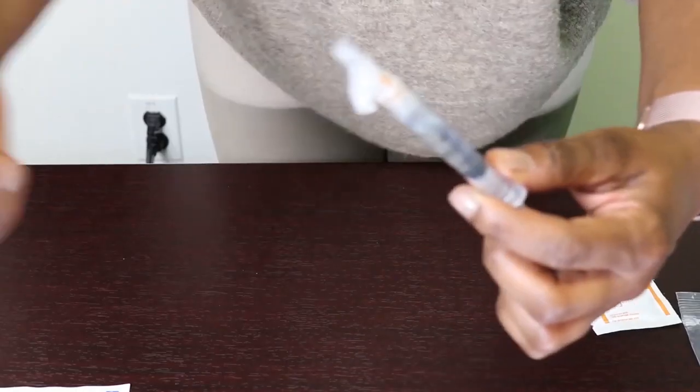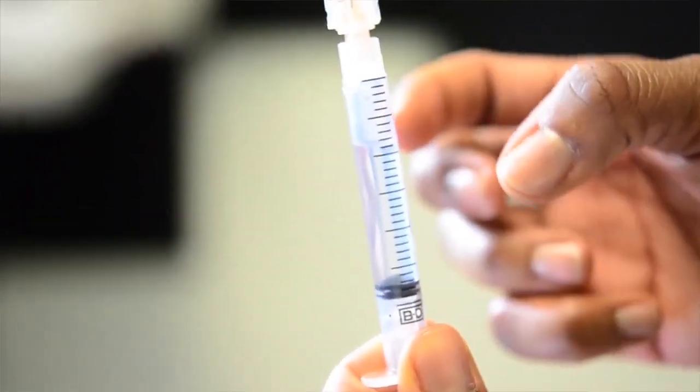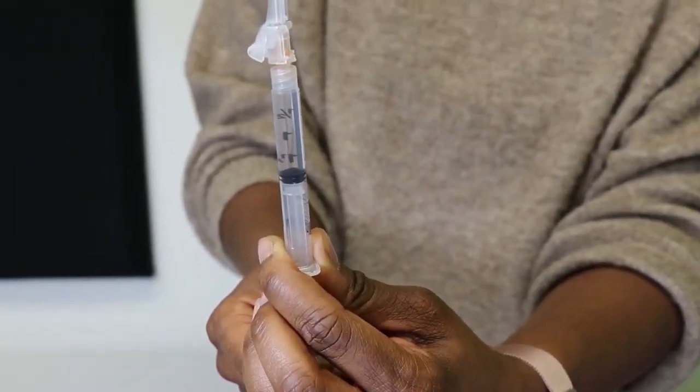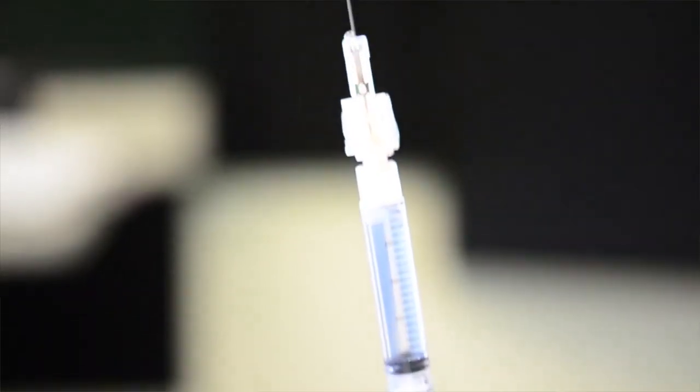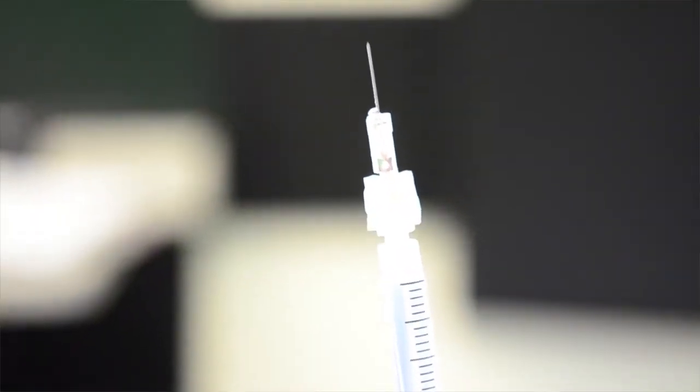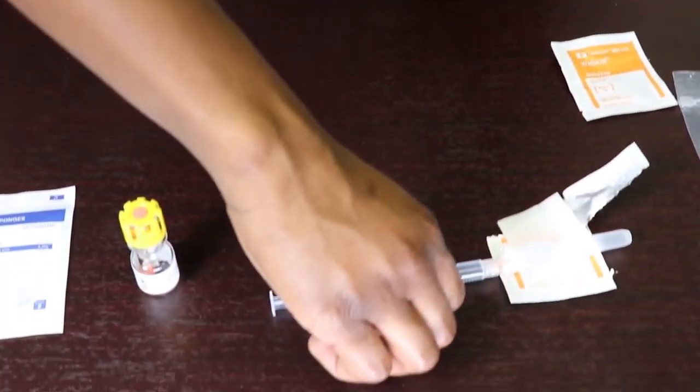Remove the needle from the vial and hold the syringe upright with the needle on top and gently flick on the syringe to move any large air bubbles to the top. Gently push the plunger until you see a few drops of fluid come out of the tip of the needle. Place the cap on the table and guide the needle into the opening of the cap using one hand, being careful to prevent sticking yourself.